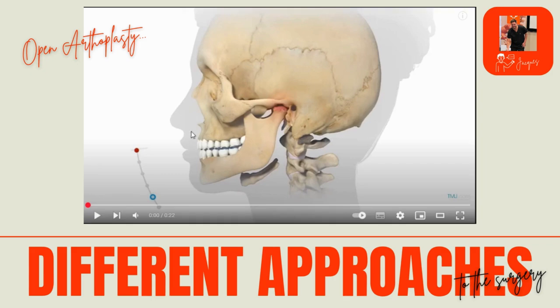And in this reconstruction, we're going to be showing you a placement of a synthetic spacer, otherwise known as a stock implant, which is affixed to the temporal bone that provides a reconstructed articulating surface for the condylar head.